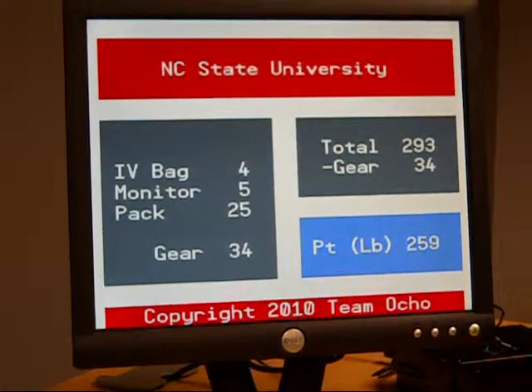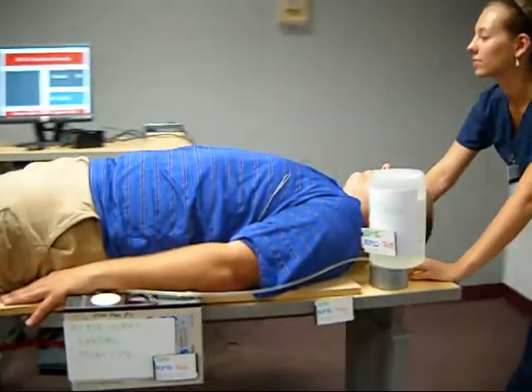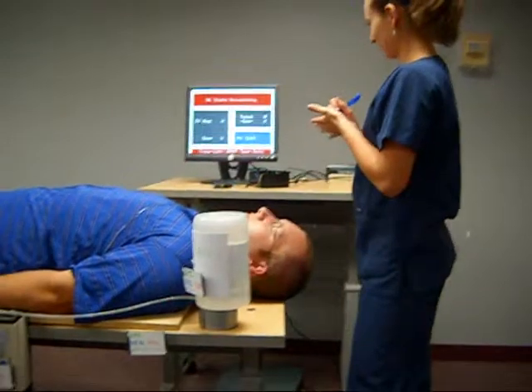Again, notice how the weight of the items are subtracted to reveal the original patient weight. Finally, with the patient weight known, the staff can utilize this information to titrate life-saving medication.